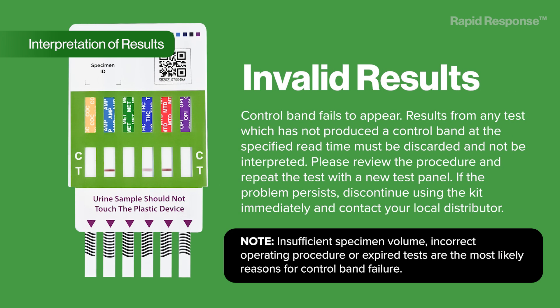Invalid results: the control band fails to appear. Results from any test which has not produced a control band at the specified read time must be discarded and not be interpreted. Please review the procedure and repeat the test with a new test panel. If the problem persists, discontinue using the kit immediately and contact your local distributor. Note: insufficient specimen volume, incorrect operating procedure, or expired tests are the most likely reasons for control band failure.